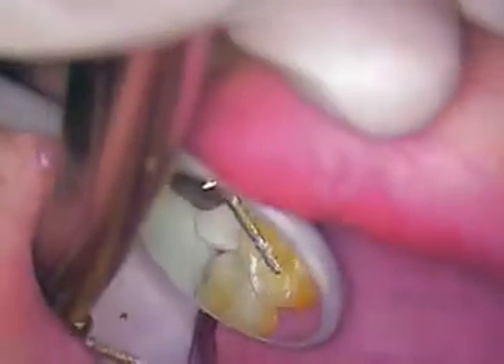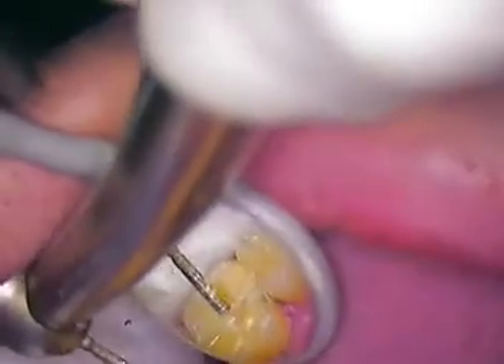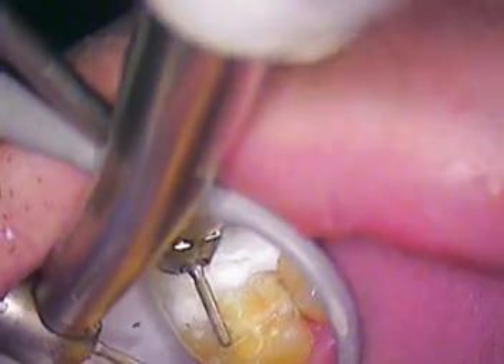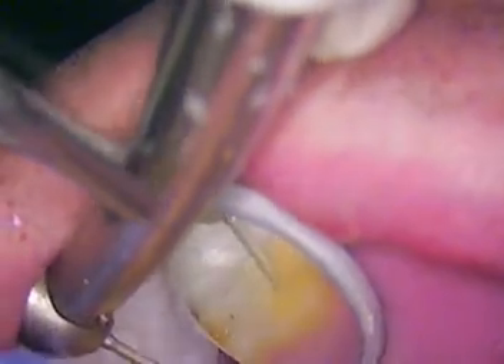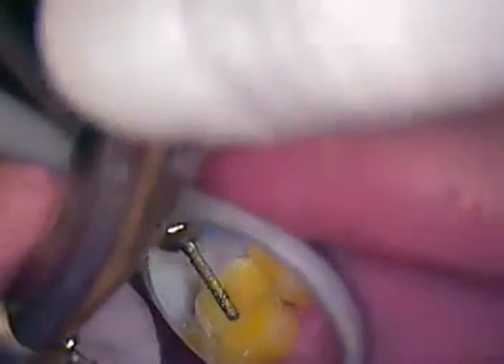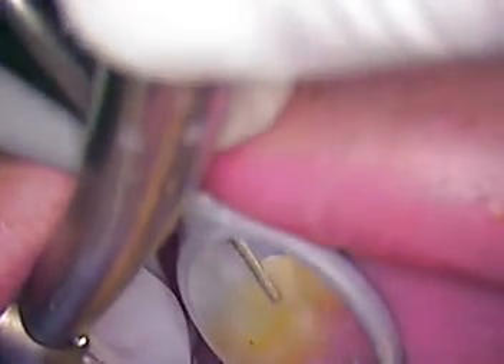All the videos are live without any interruption or editing. We'll reverse now — I'm going to switch places and come over here in just the opposite direction. I'm going to come in at the shape of a V from this angle, because we want to create anatomy in this tooth. I'm going to build back in so that he has better chewing.